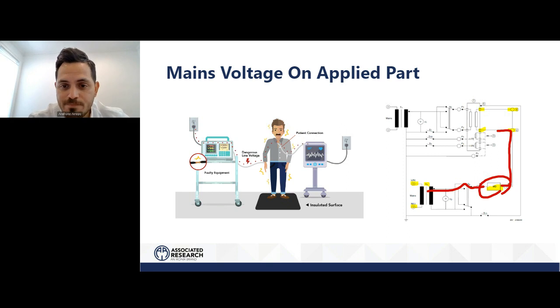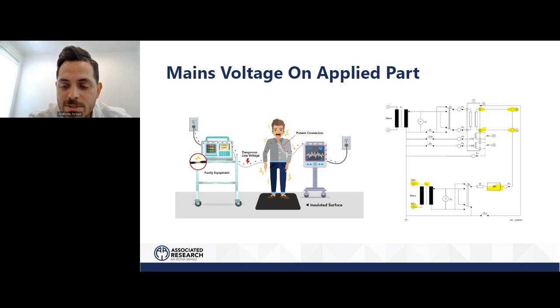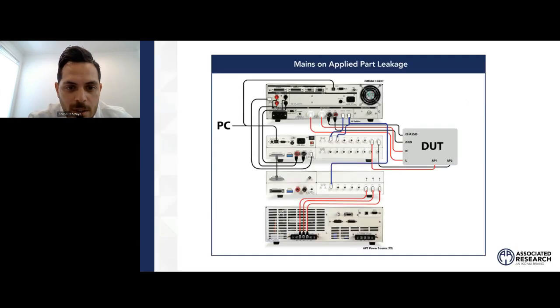And so this is the beauty of the MedTEST system, right? The second scanner I haven't brought in yet, right? But if you recall, the MD, let's pretend this is a human body with two arms. One side is coming into contact with the applied parts, the other side, the line of T2. So here, the MD falls between probe high and probe low here. Okay.